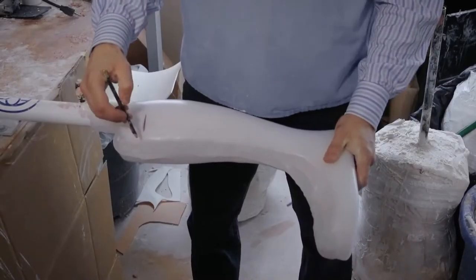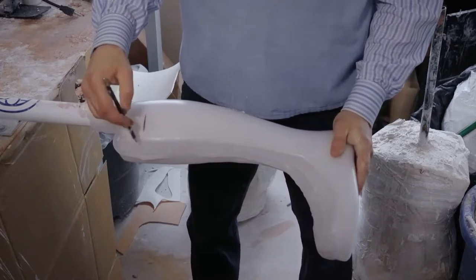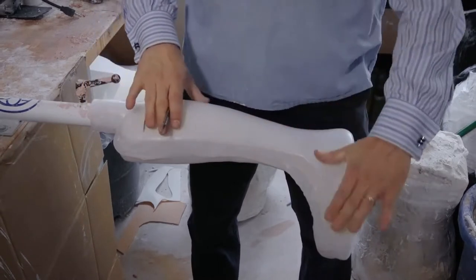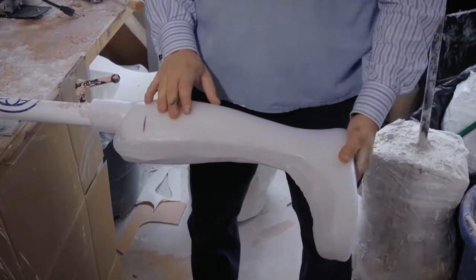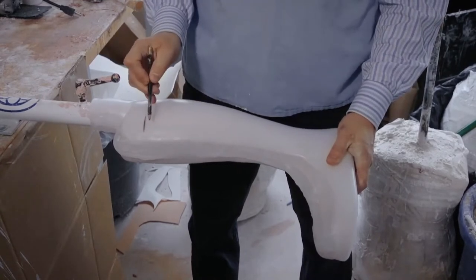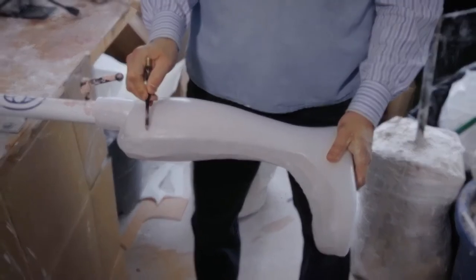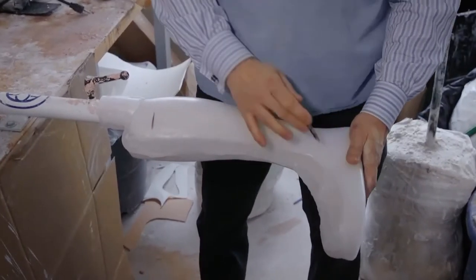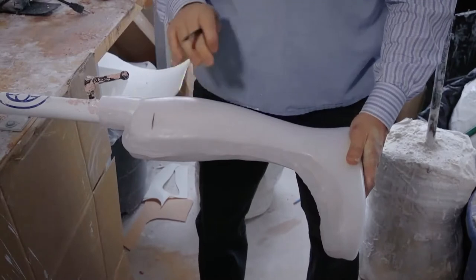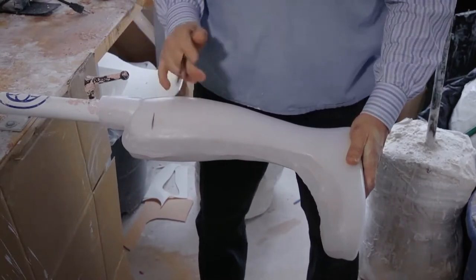All right, so today we're going to talk about taking the next step on our AFO fabrication. I have an AFO here in its basic shape, meaning we need to take it from where it is now. We need to carve it out of this mold that you see here. There's a plaster underneath this plastic, and so we now have to create this.